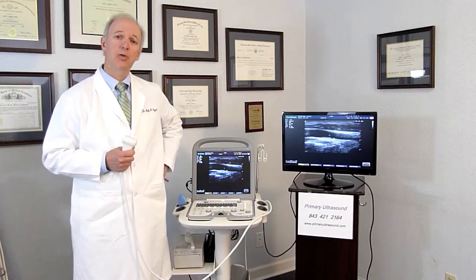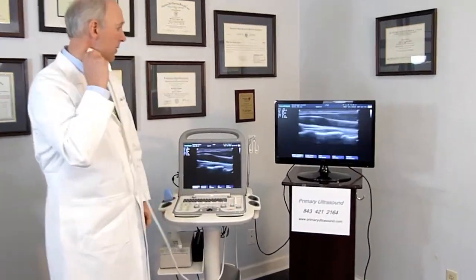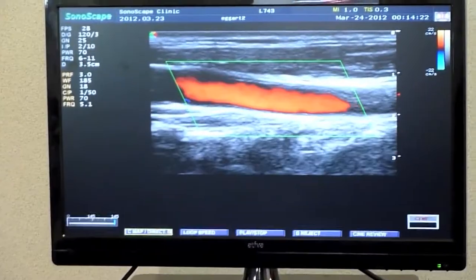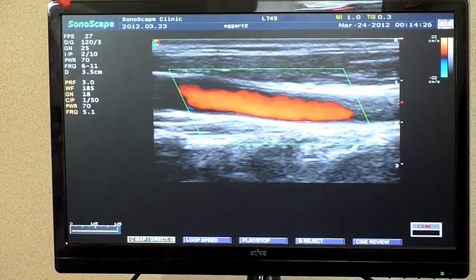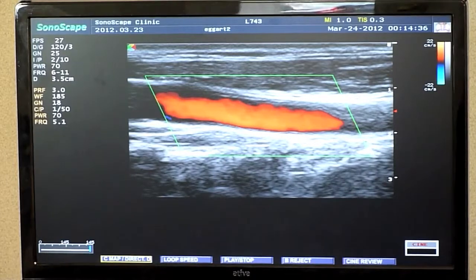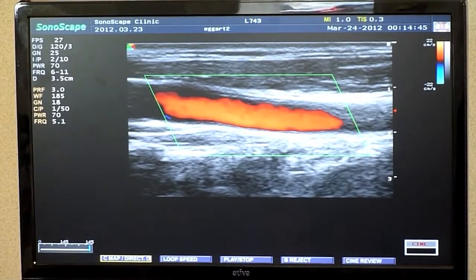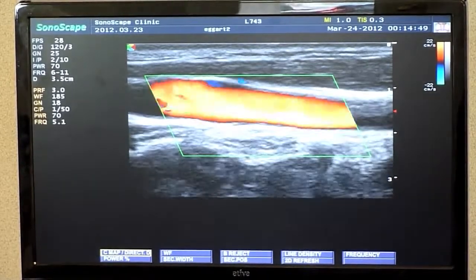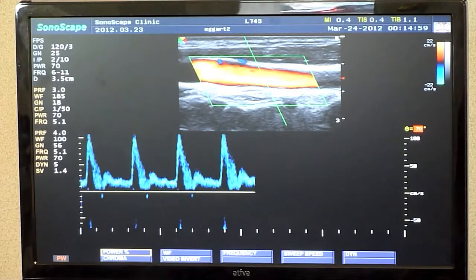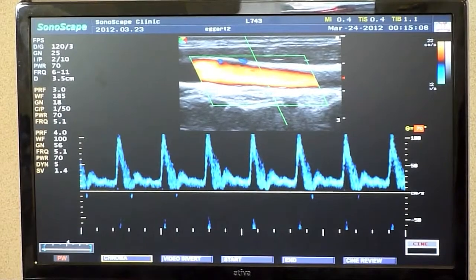The next thing you may want to do is use color flow imaging to look at the blood flow, and that's what you can see here on the monitor. We find this particularly effective with patients — we always have a secondary monitor in the room. When there's plaque present in the carotid system, as they see the blood flow over the plaque, it really has a great impact on the patient's motivation to improve their risk factors. We can also look at wave analysis, and you can see the spectral wave analysis when using the Doppler. This would be a carotid duplex examination.